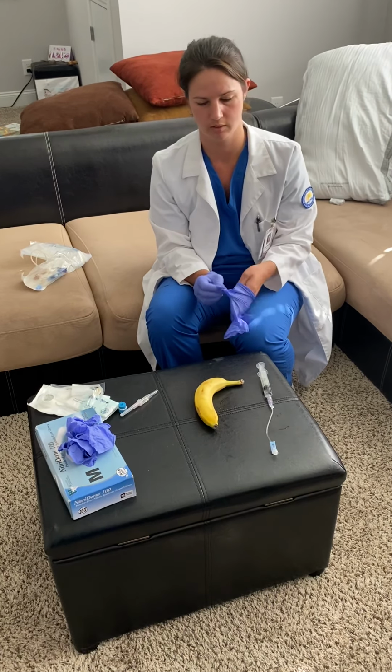And I'm going to take my tourniquet. Now I'm going to make sure that my tape is ready to go. I'm going to place the tourniquet 2 to 3 inches above the IV site with a quick release knot here. I'm going to palpate gently here. So I've got my vein. I want to release the tourniquet.